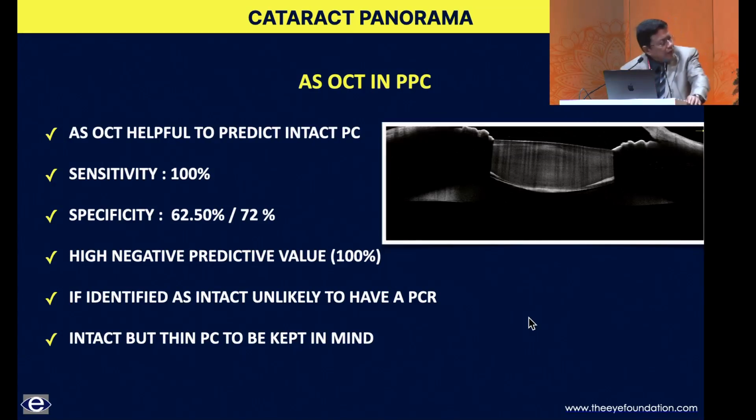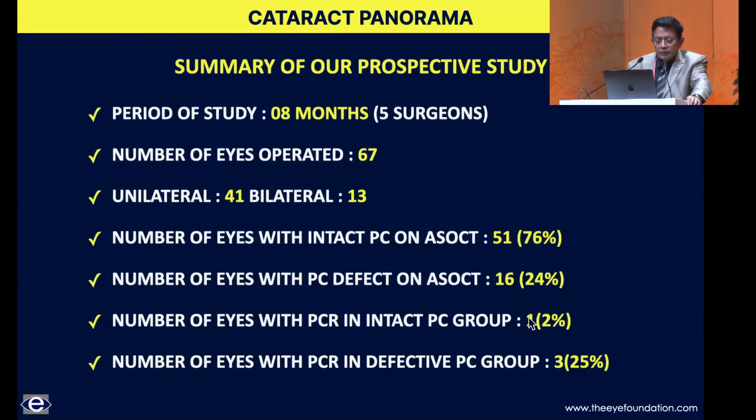Would like your inputs on this. Oh, that's fantastic. How often do you find where you think it's intact and then you do your regular technique and it splits? As I showed you, it's happened in one case. One. Oh, okay. So just in 2%. Yeah. So we had published this about 2015 or 16.